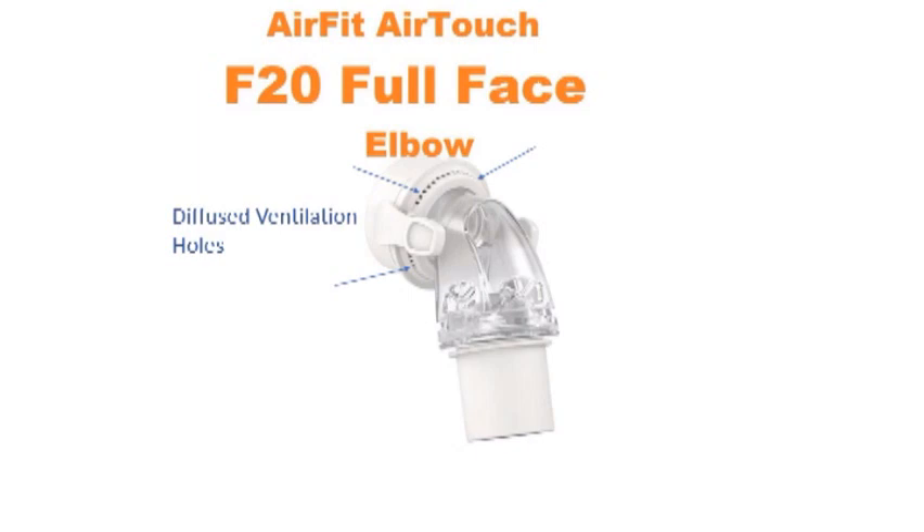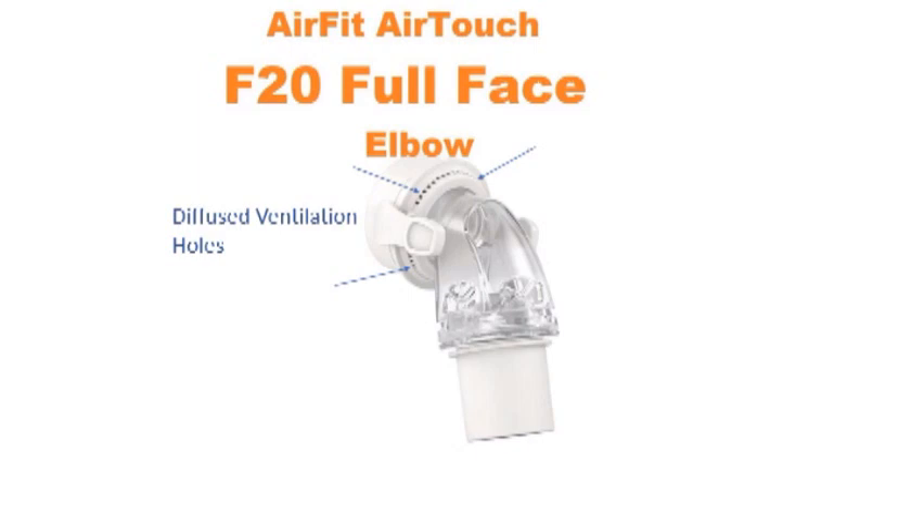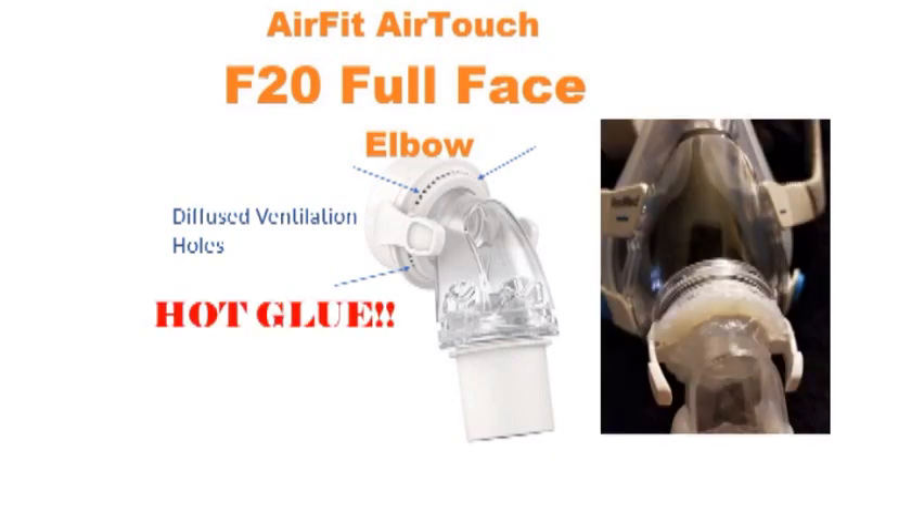Let's look at this elbow. Those are diffused ventilation holes — that allows you to breathe out CO2 so you don't get sick. What we're going to do is take some hot glue and put it along those little holes, seal it up nice and tight like that picture shows right there.